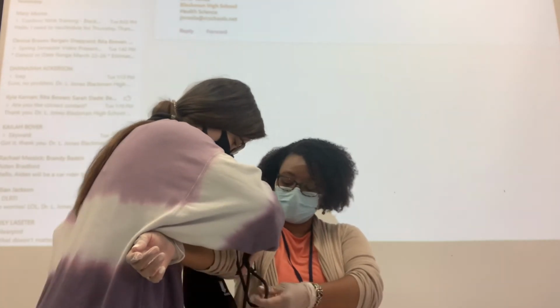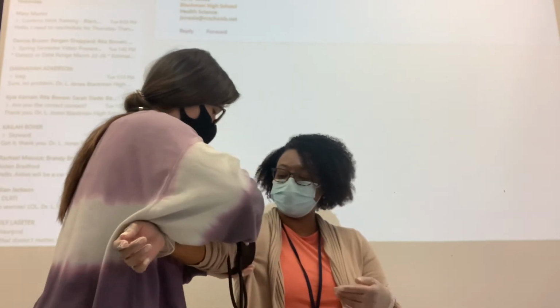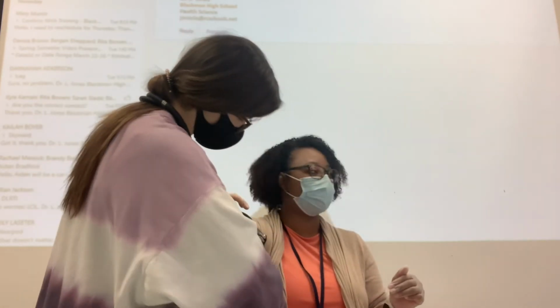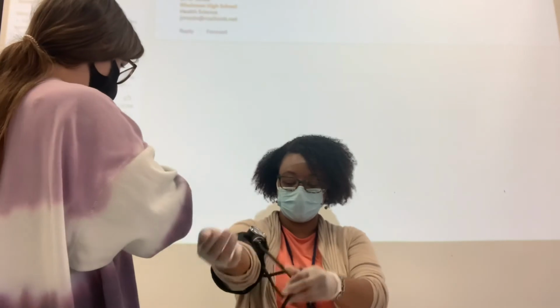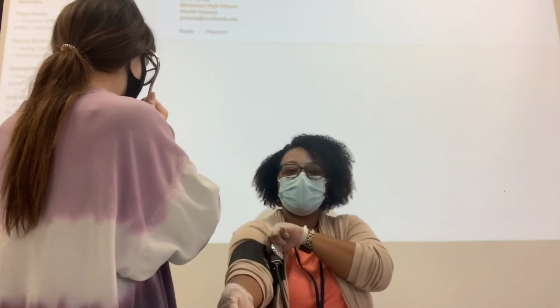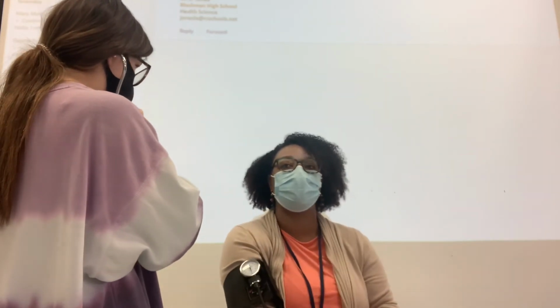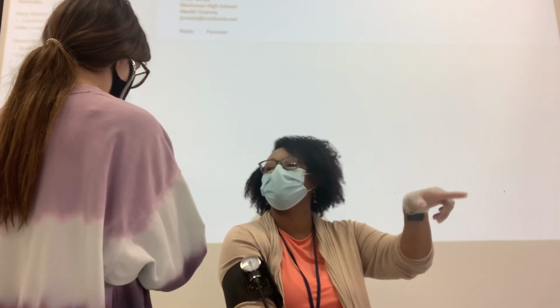And you always tell your patient what you're doing. You just let them know, I'm gonna reach under your arm, so that they don't get kind of weird on you. All right, so I'm gonna lay my arm down a little so it's not moving too much, so she has to pump it up because you're not gonna put it on extremely tight. All right, if you can't see, I'll move over here if you want to see.